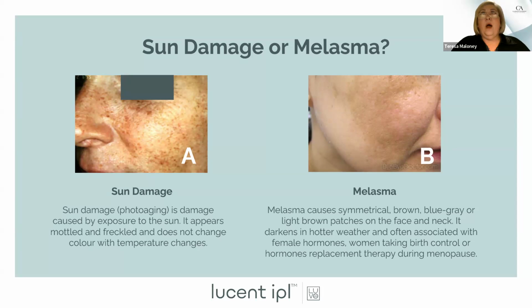No, not the 430. The 430, I wouldn't go beyond a skin type 3 with it. Again, remember too, the melanocyte is very superficial. So the number that you're using as well, the higher the number, the deeper you penetrate in the skin. So if you're using the 430 on a skin type 5, you could cause some serious problems there. But up to a skin type 3, safely use it.